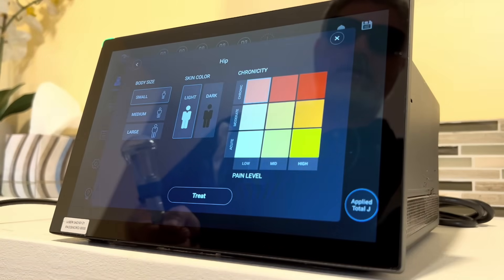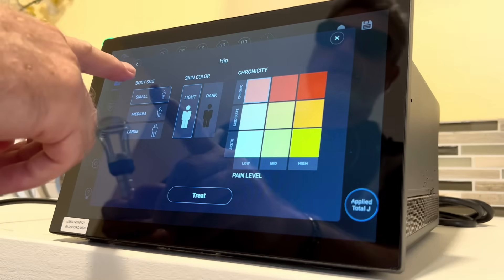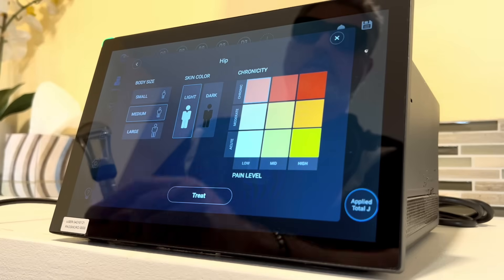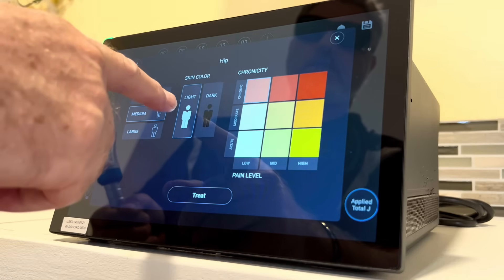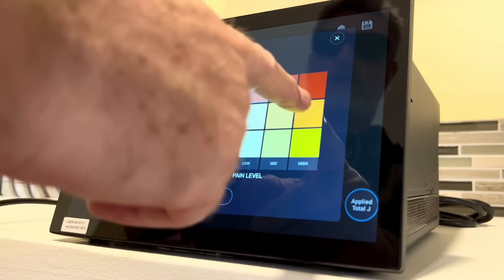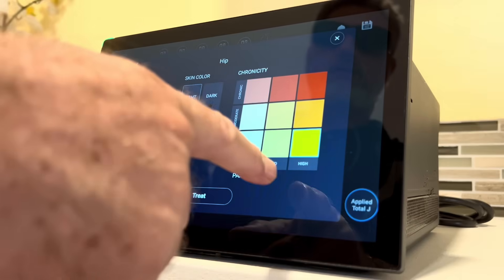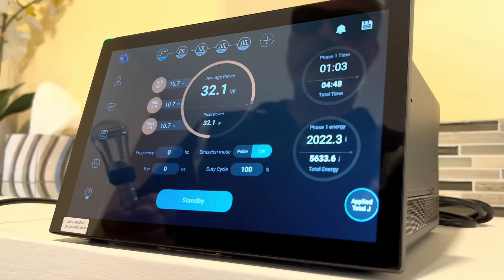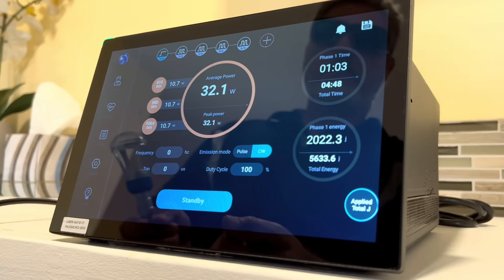Let's try the hip protocol. Whatever protocol you choose, you get this opening screen where you choose the body size: small, medium, or large. Imagine we're working with a medium person with light or dark skin — you get to choose. Then you select the chronicity and pain level; say someone's got a lot of acute pain, go with that section, then press Treat.